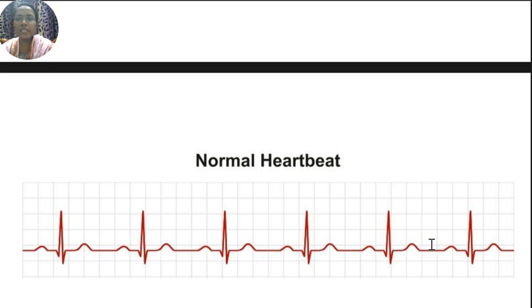After the ECG, the physicians can go for ultrasound imaging, CT imaging, MRI, PET, SPECT or any kind of imaging, and thermodilution methods to find the stroke volume. These are the secondary methods. The very basic preliminary diagnostic technique used to identify disorders of the heart is the ECG.